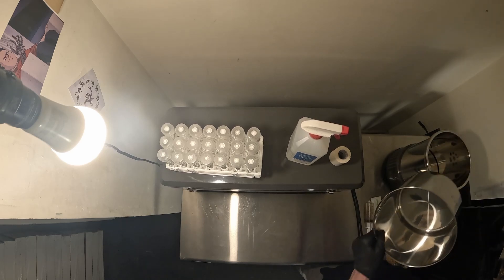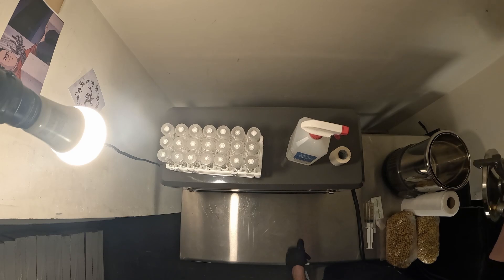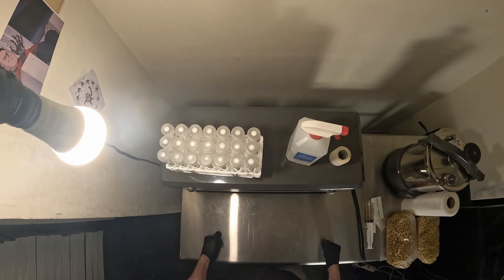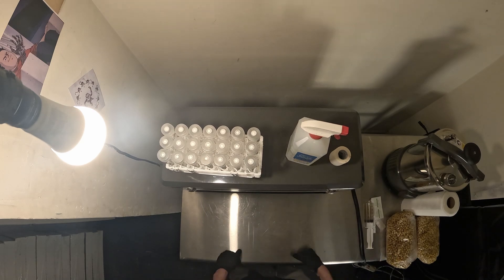Essentially with the autoclave you're just putting some distilled water in there, put your culture vessels or whatever you're sterilizing in there, put the lid on and run it. I already had a couple pressure cookers so that wasn't as exciting, but the flow hood is what I was super excited about. I was initially looking for one for growing mushrooms and mycology stuff.